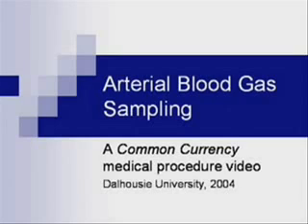This is a video of arterial blood gas sampling produced as part of the Common Currency Project at the Dalhousie University Faculty of Medicine.